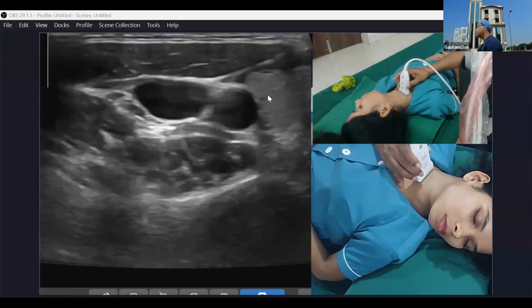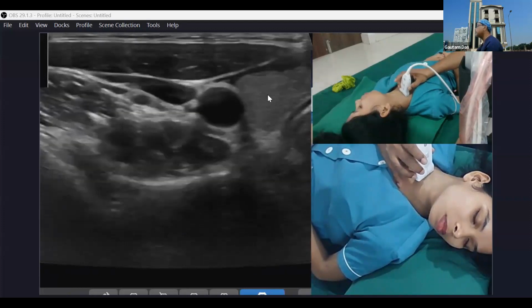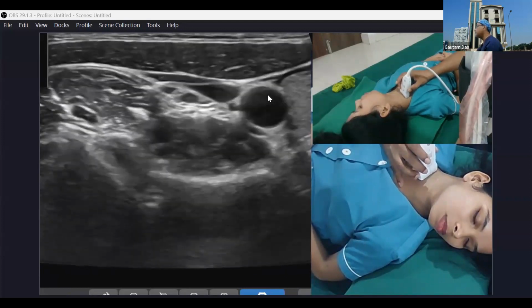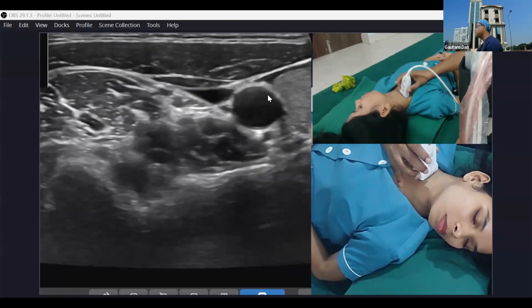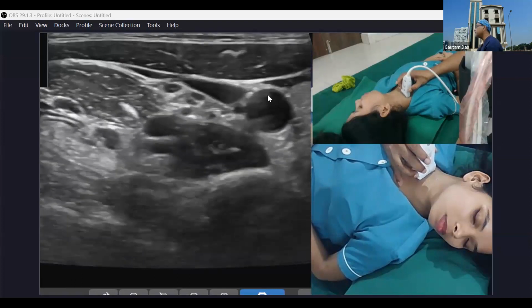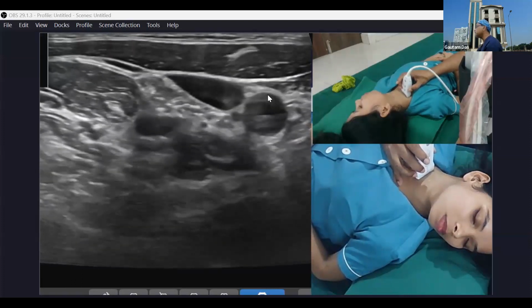So, okay, you should not be injecting here. You can inject here or inject a little down the longus colli muscle. When the inferior thyroid artery is not in your field, the inferior thyroid artery has moved lateral. So here you can inject above the longus colli muscle.